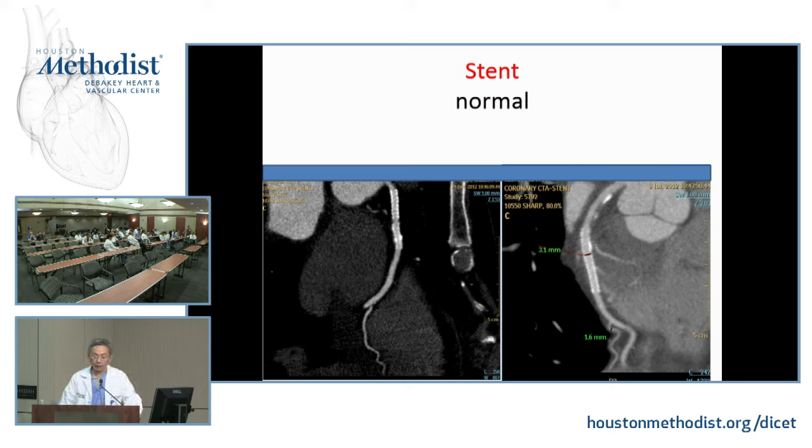I completely agree. I think we go case by case. Someone who has a calcium score of 900 or 1,000 and a heart rate of 90, I probably would never do that. But if the heart rate is nice and slow, in the 50s, I'll take my chance, depending on the clinical question. But now we have PET, I think it's a tremendous opportunity.